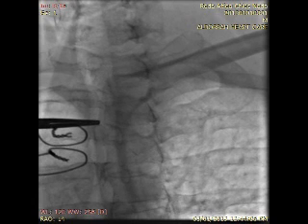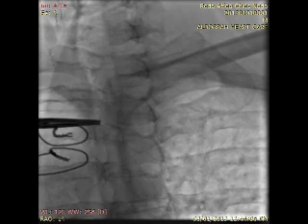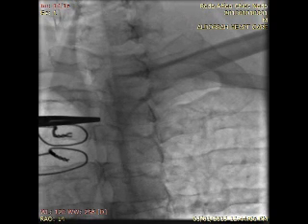With the aid of x-ray guidance, the fluoroscopy tube is rotated 15 degrees in an ipsilateral fashion in order to delineate the lateral aspect of the vertebral body.